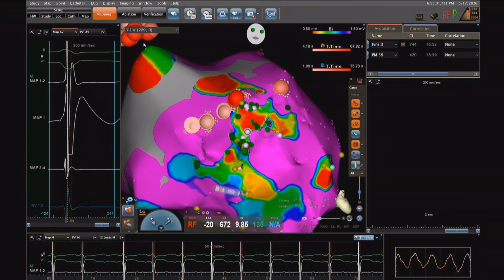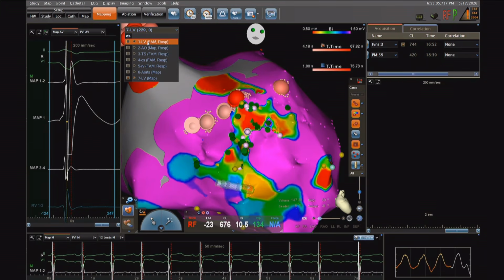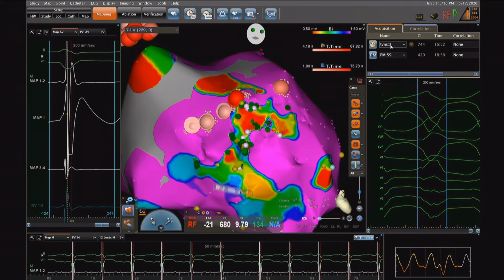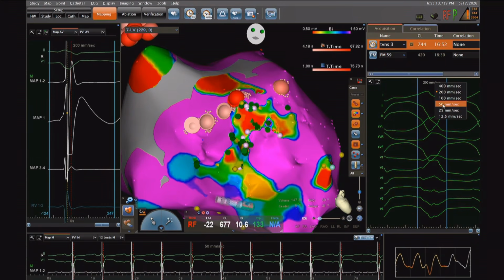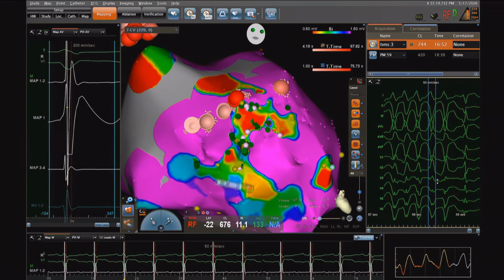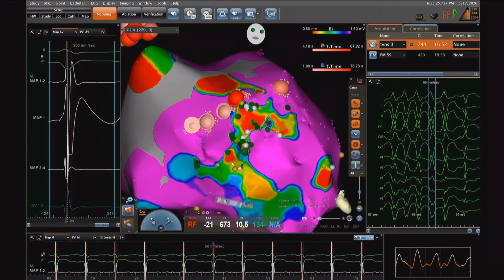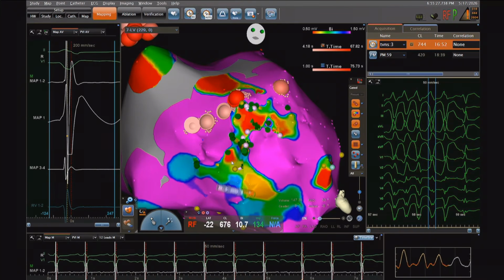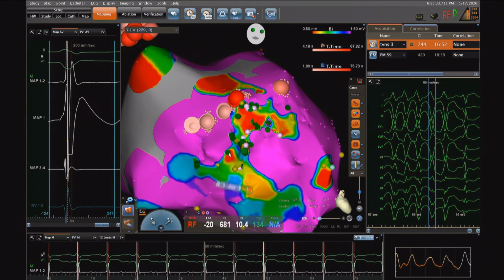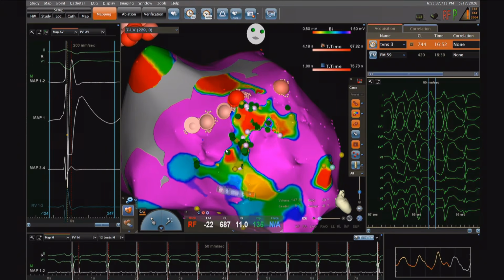in the left ventricle at different sites because, and we did not show you that before, before we could induce the VT, we had several runs of non-sustained VT, and one here is very interesting because as you see the morphology, it's negative in 2, 3, aVF, positive in V1, V2, and you have a transition between V3 and V4, which suggests an inferior origin in mid-distance, I would say, between the apex and the septum and the base, but closer to the apex. And this would fit with the inferior wall, in fact.